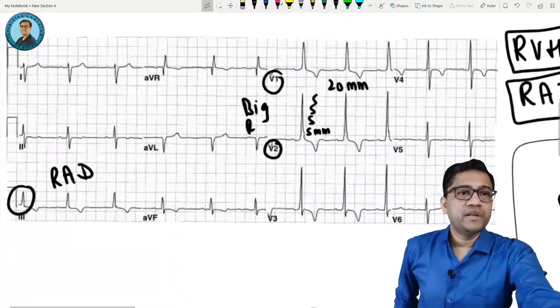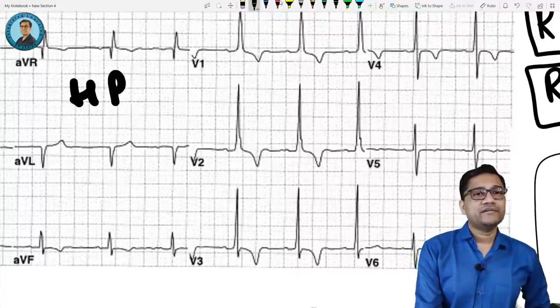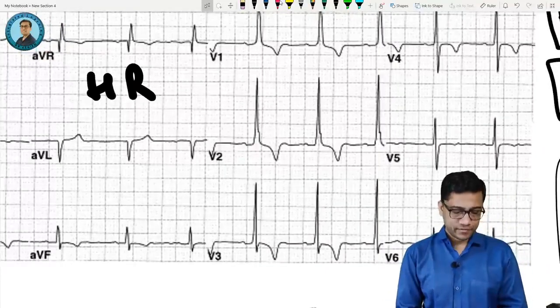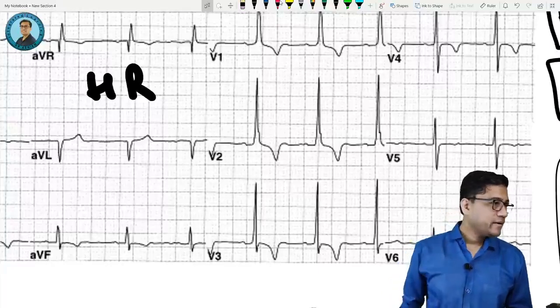So question to you people, can you calculate the rate here? What is the heart rate here? Calculate. Count the boxes, calculate the heart rate.